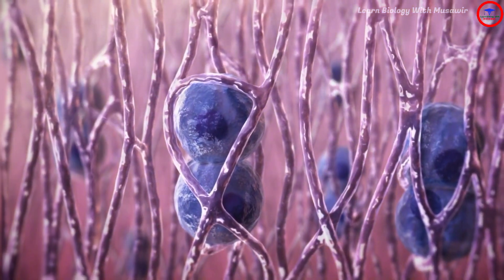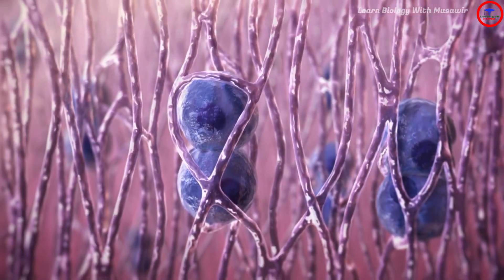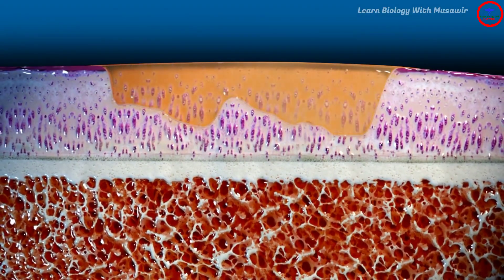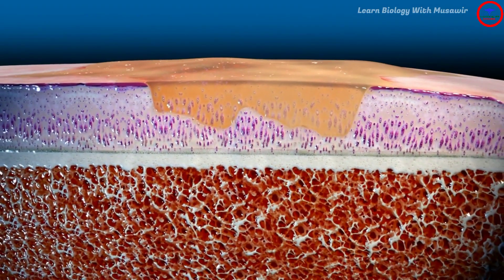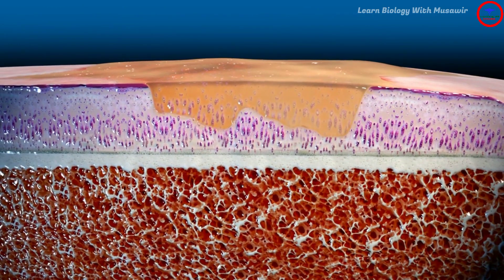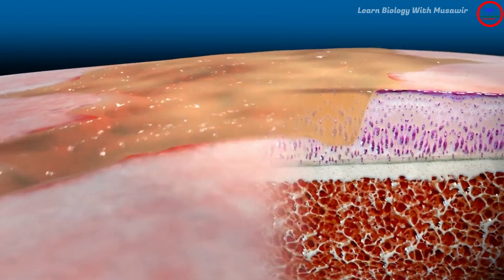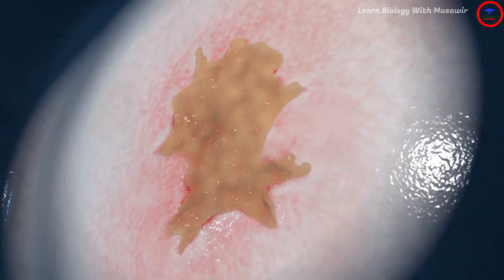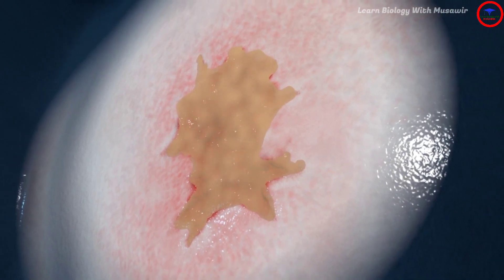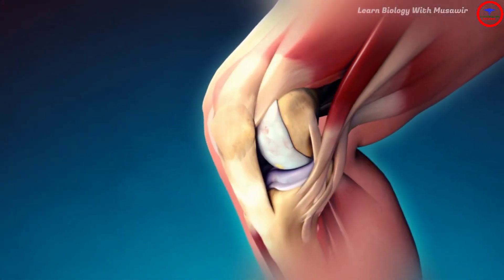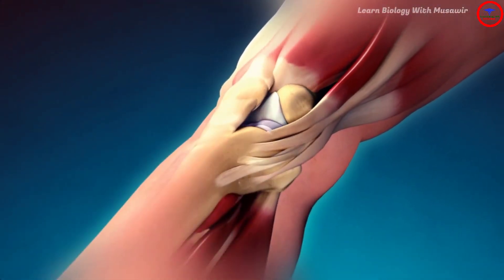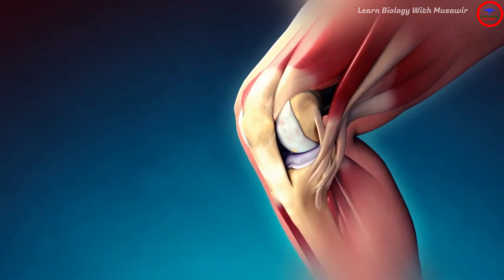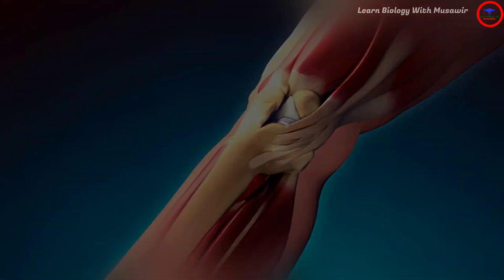Eventually, the polymers of the injectable plaster are replaced by newly formed tissue. The injectable plaster protects the damaged cartilage against further erosion and stimulates its regeneration. Injectable plasters have the potential to cure osteoarthritis of the knee.